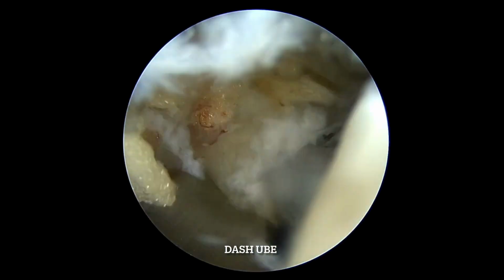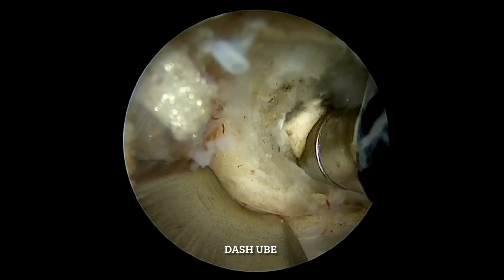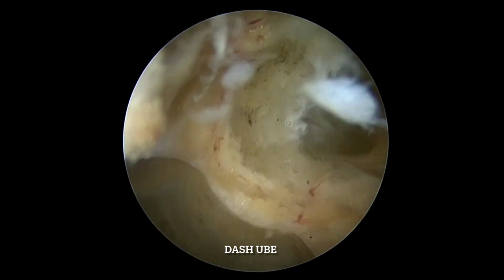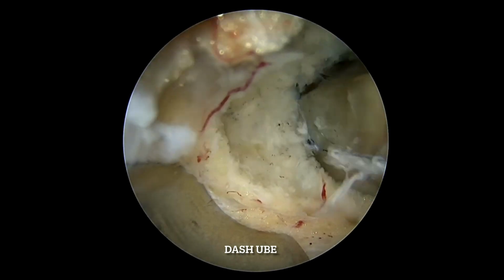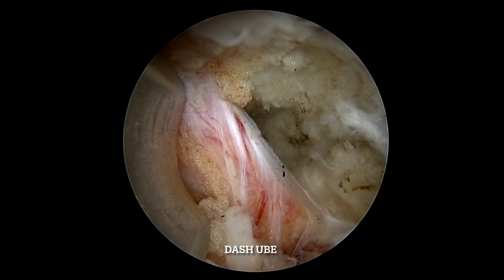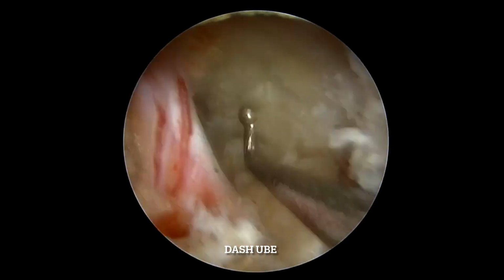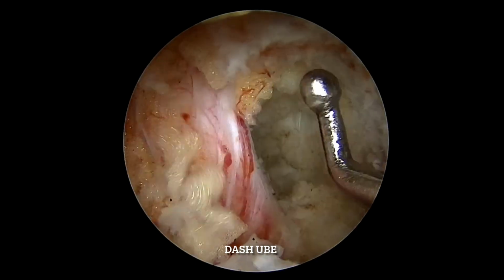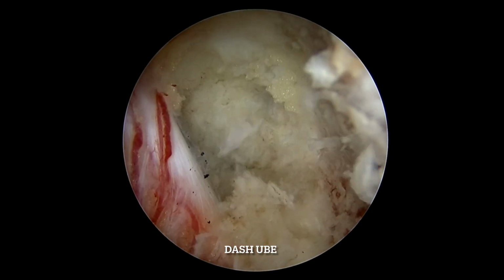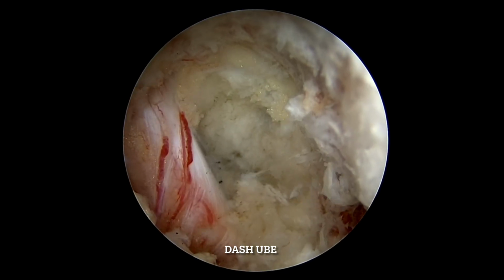So I'm removing the disc. Some part of the epidural fat is also poking out. I'm trying to shrink it, simultaneously trying to remove the disc through the foramen. See, now the root is decompressed well. The blood vessels are trying to flow through it, which is an indirect evidence of good decompression of the exiting root. Now this is the annulus border, the posterior annulus border, which is visualized, and the disc has been removed.